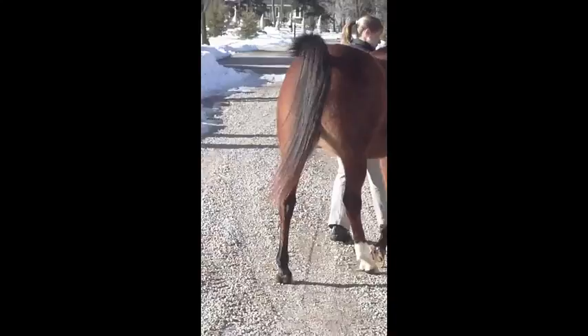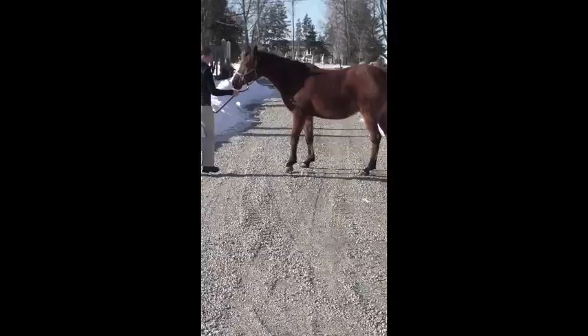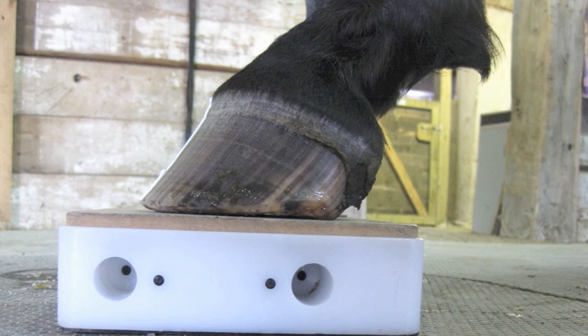Here we are with Skat. She's a 20-year-old Arabian with a slight case of laminitis. We saw in the videos that when she was turning, she was a little bit ouchy. What we're going to do now is take some x-rays so we can find out where we want to place the wooden clogs, and then we'll show putting the clogs on.